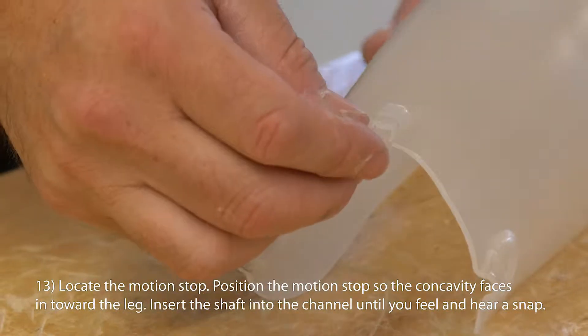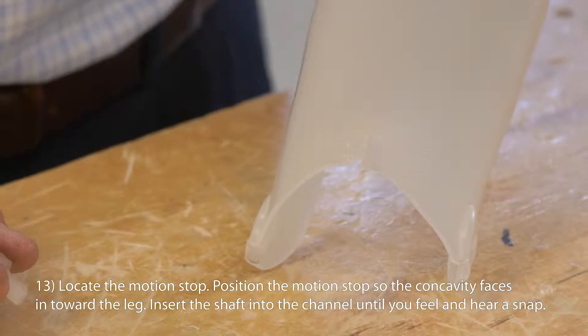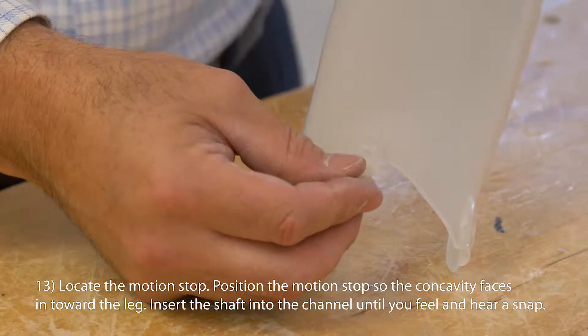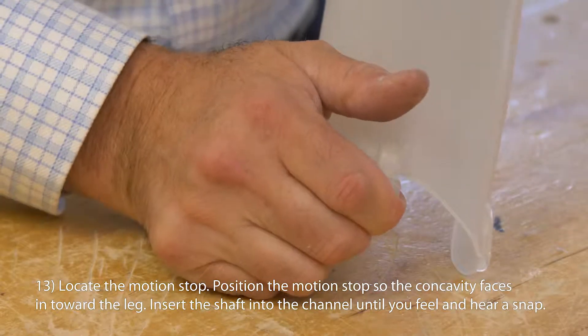Locate the motion stop. Position the motion stop so the concavity faces in toward the leg. Insert the shaft into the channel until you feel and hear a snap.